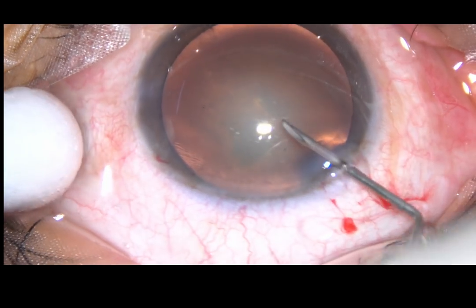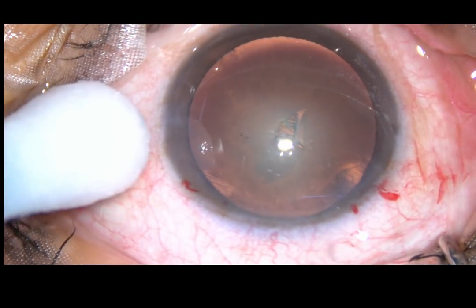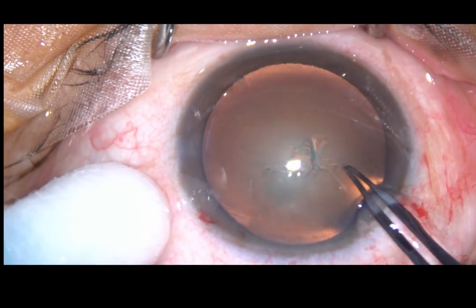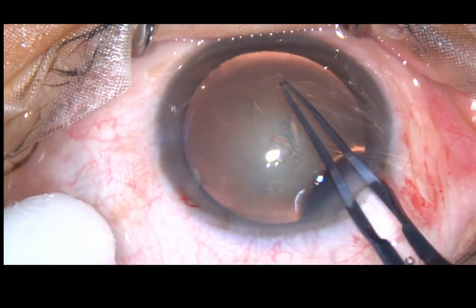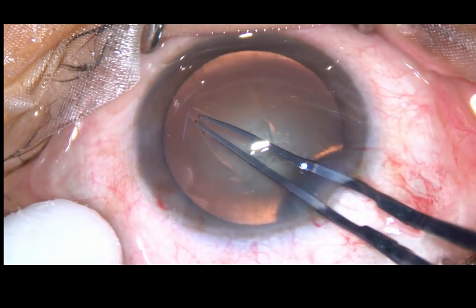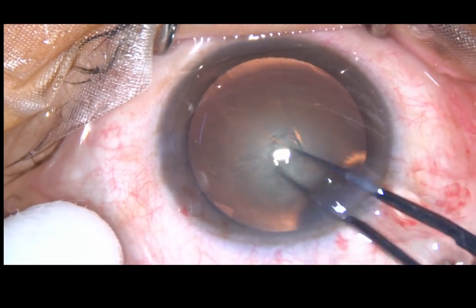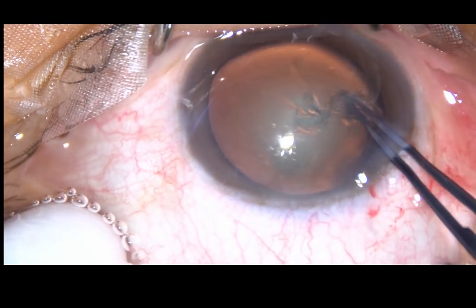The anterior capsule is incised with a 26-gauge bent needle and a capsular flap is raised. I hold this capsular flap with a Utrata forceps, go anti-clockwise and do a continuous curvilinear capsulorhexis. This is a fairly round rhexis, though a little eccentric.